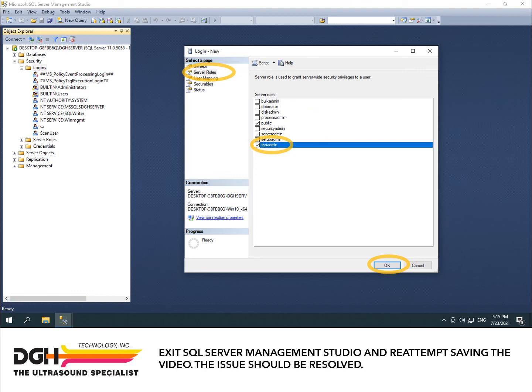Exit SQL Server Management Studio and re-attempt saving the video. The issue should be resolved.